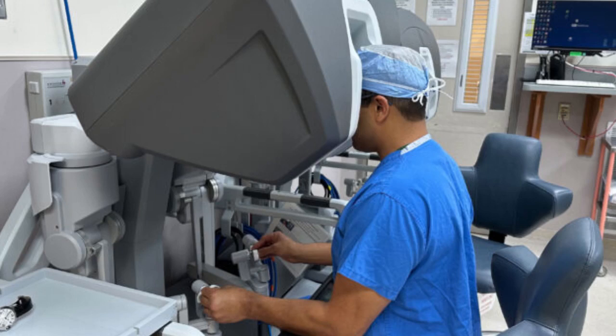Robotic surgeries are a kind of minimally invasive surgery. Surgeons maintain complete control of the robot's tools and perform the operations remotely, usually just a few feet away from the patient, using joystick-like controls. High-resolution cameras provide a magnified 3D view of the surgical site viewable via a large monitor. The high-tech instrumentation allows for very precise, fine manipulations that would be impossible using traditional techniques.